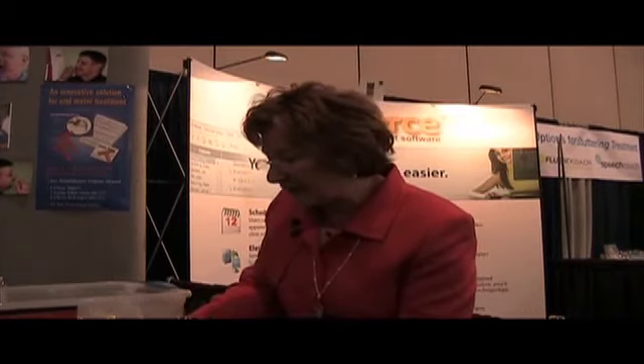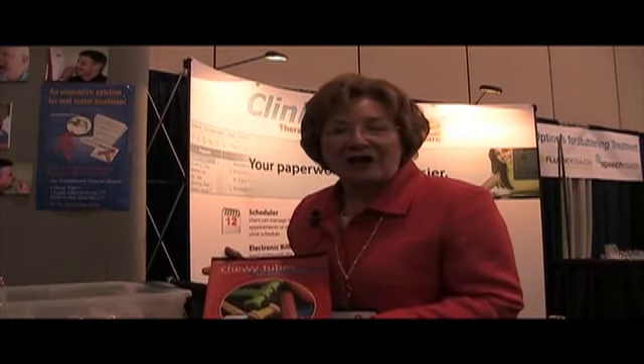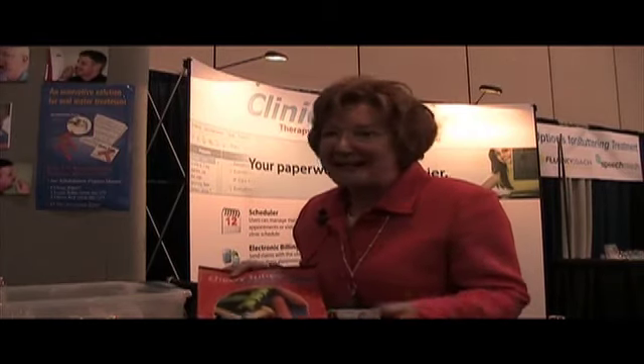So that gives you a little bit of information about Chewy Tubes and the jaw rehabilitation program. Please visit us at ChewyTubes.com to learn more and to see how the Chewy Tubes are used. Thank you and have a great convention.